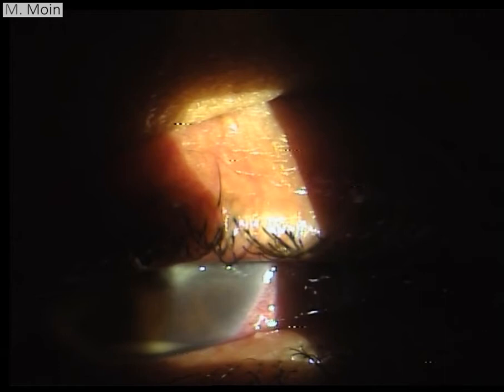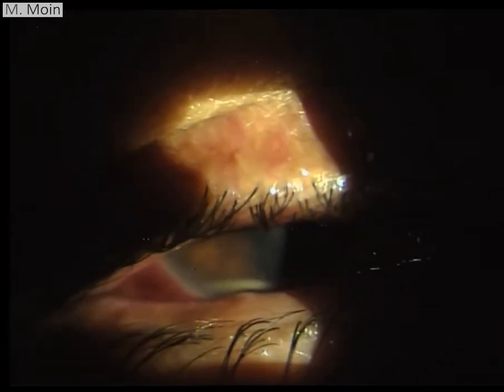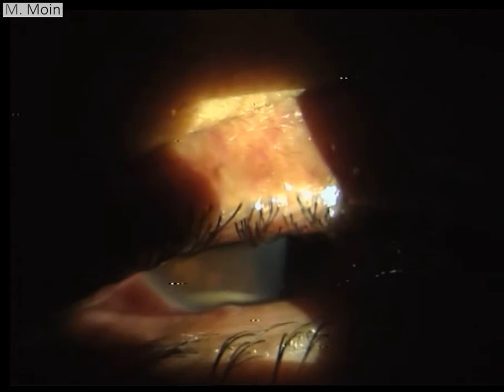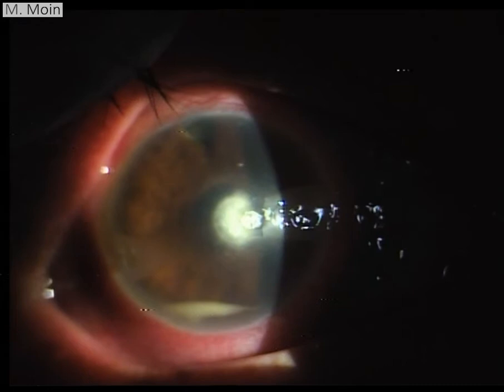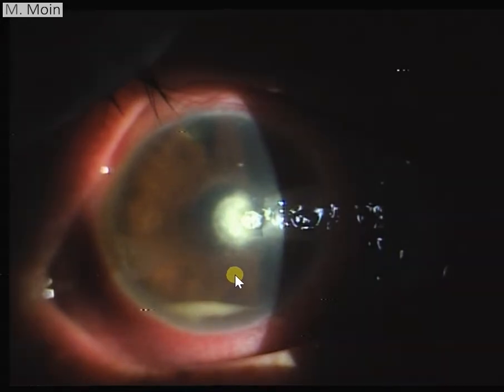Welcome to this video on anterior segment examination using the slit lamp. So we have a patient in which we see a hypopyon and there is corneal ulceration. Well, there is another interesting finding in this patient as well. Let's see if you can figure that out. Let's go through the different steps.